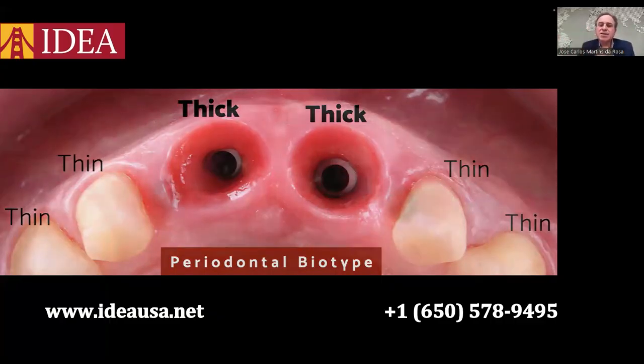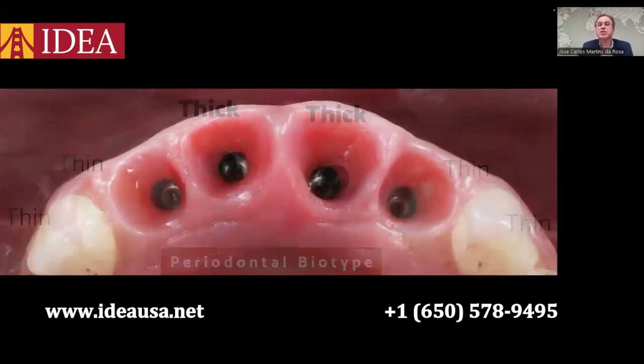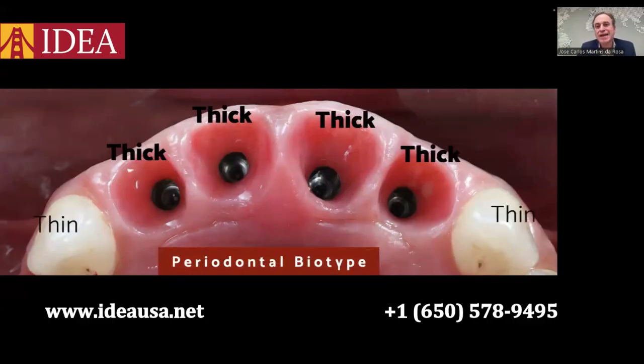And how about this case? We perform IDR technique to replace 4 incisors in one single shot, one single surgery. And let's focus again on the evaluation of the periodontal biotype. And again, we have a thick periodontal biotype around implants and thin periodontal biotype around natural teeth. That's the main difference and the main advantage of the IDR technique to be applied in your daily practice.